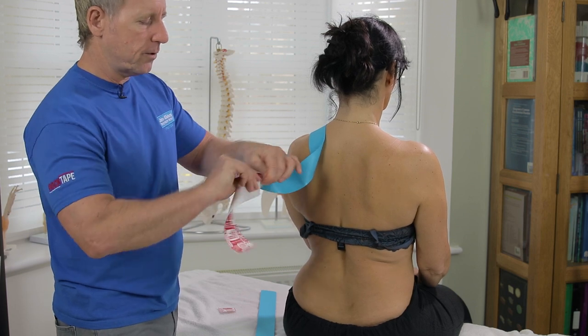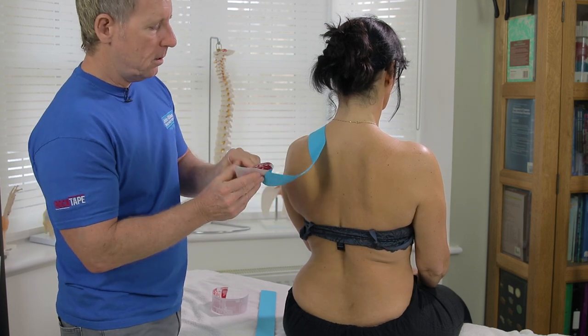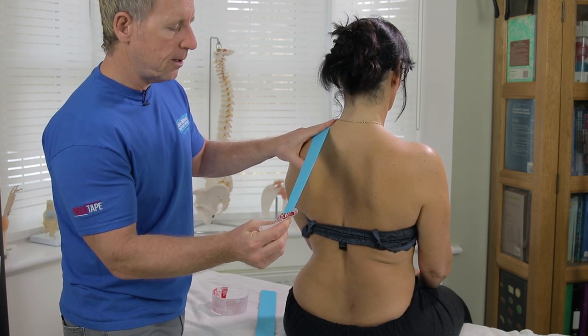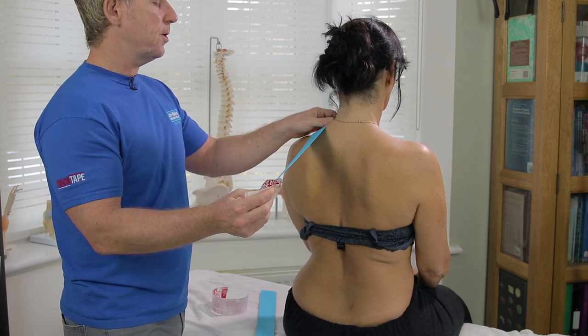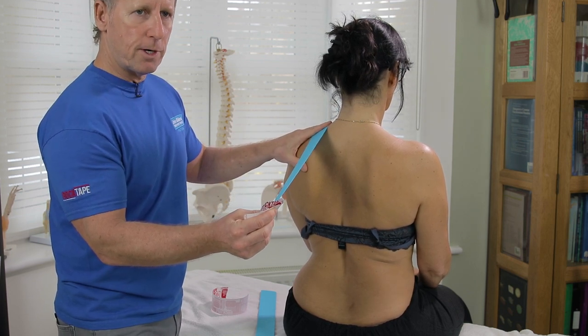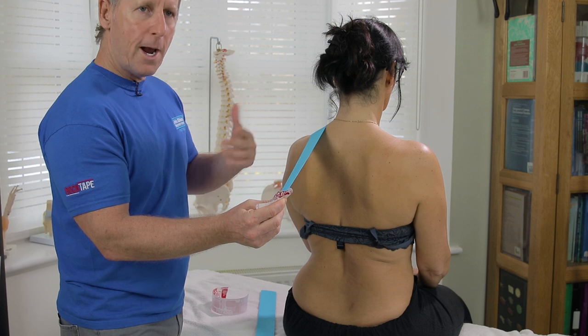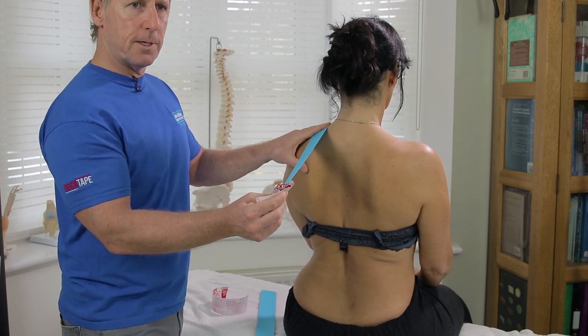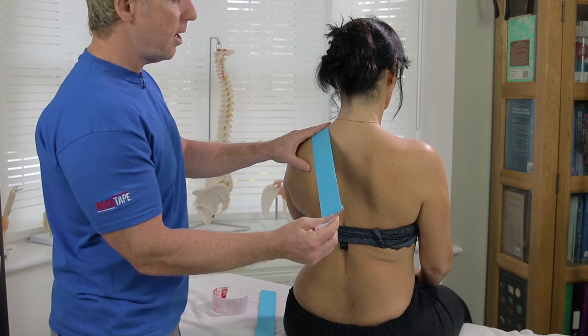So this would be known as 100% stretch, this is 50, this is 75. If the patient wanted a bit more control then I'd suggest maybe around 75% stretch. If they just want an awareness of the tape and don't want to be pulled back, I'd probably suggest around 50%, so we'll do 50% in this case.